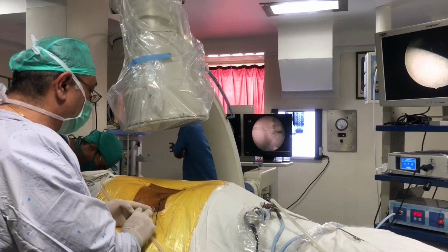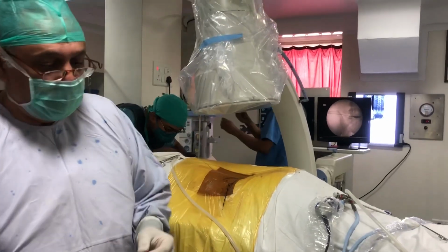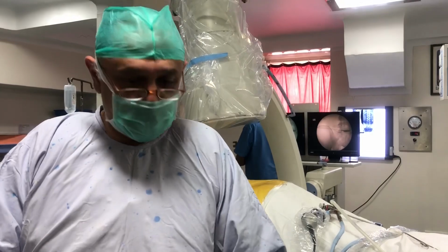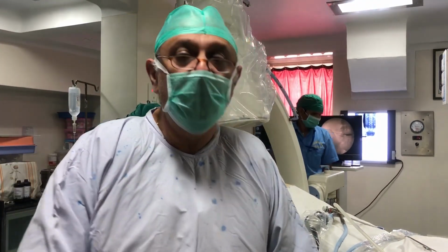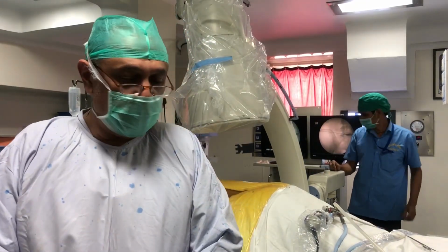Since it's a positive and provocative discography with the dye leaking into the canal, we will now be proceeding with our regular endoscopic decompression of the spine. We will be visually identifying the annular tear, removing all the nuclear material from it, and doing an annuloplasty. Thank you very much.